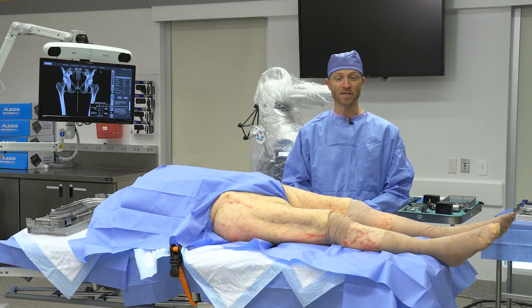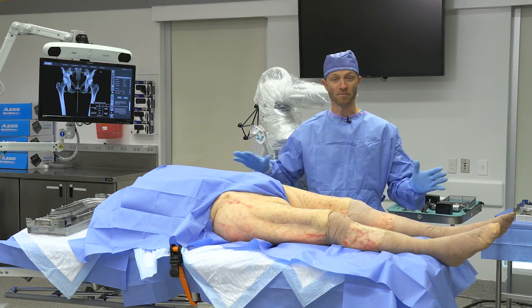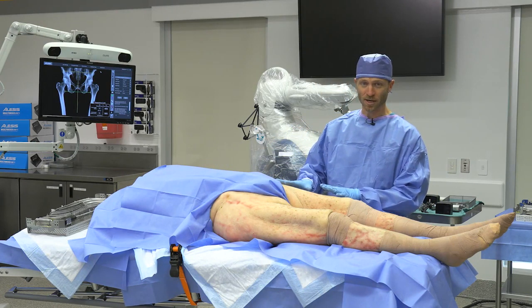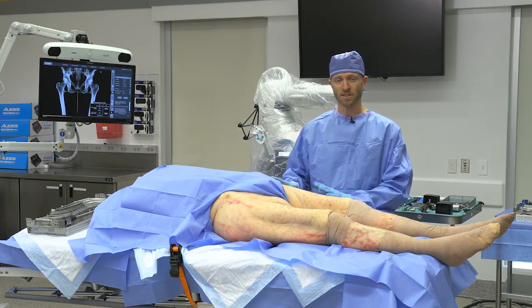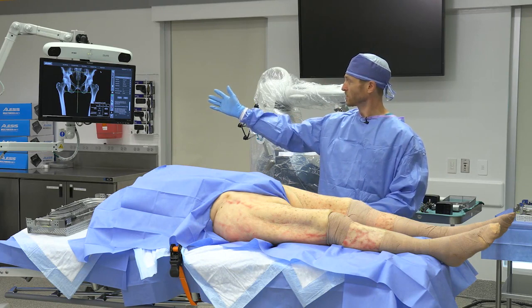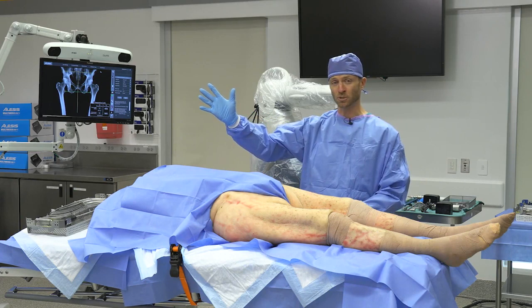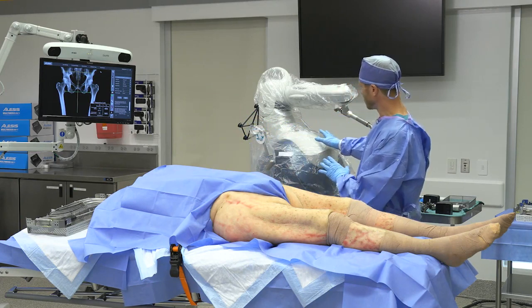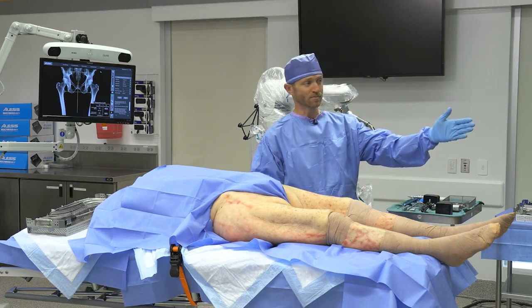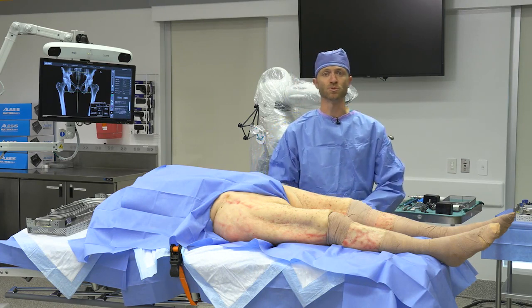We are here to do a Mako Total Hip 4.0 from a direct anterior approach. I'm going to orient you to everything that you can see here. I'm on the ipsilateral side of the patient for hip replacement. To my right, your left, is the camera, which will be visualizing the stereotactic arrays. Right behind me is the robotic arm, and off to your right, my left, is the guidance module and your Mako product specialist that takes you through the case.